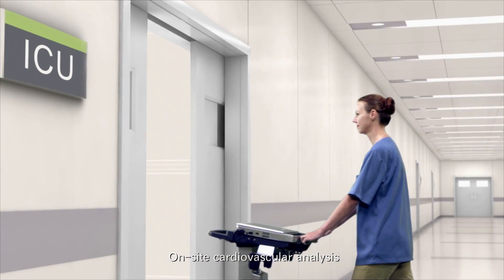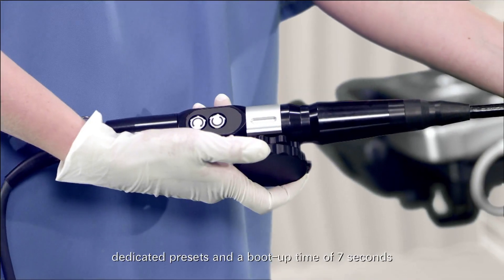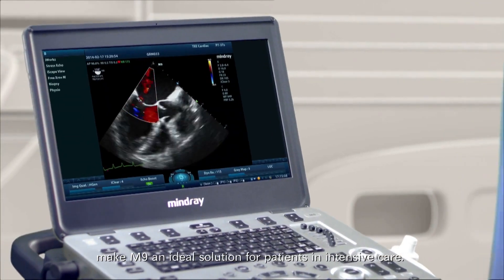On-site cardiovascular analysis, dedicated presets, and a boot-up time of seven seconds make M9 an ideal solution for patients in intensive care.